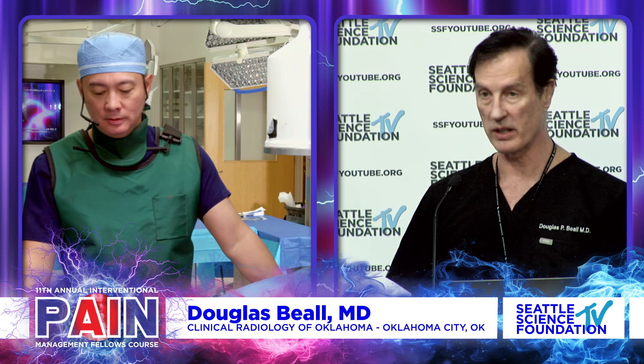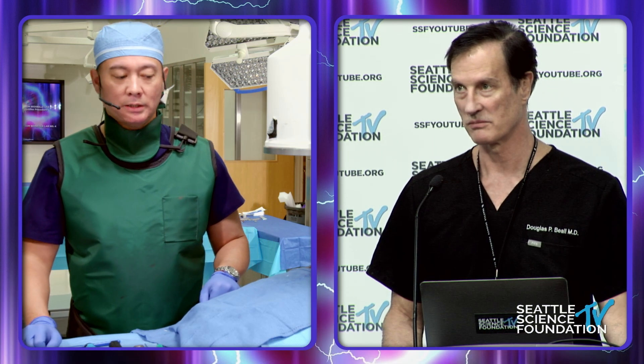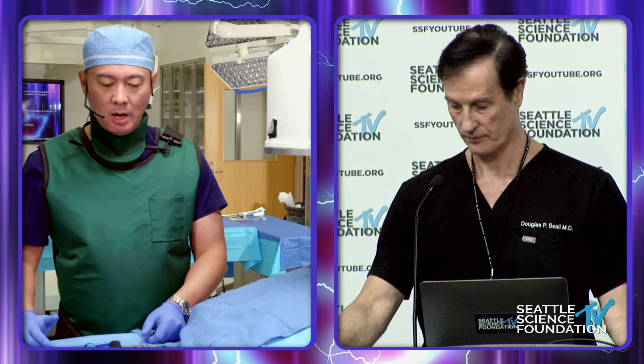We will move on to the SI joint fusion, the posterior approach with the cortical allograft, and this is going to be done by Dr. David. It looks like he's dressed and ready — locked and loaded. Dr. David: yeah, we are set to go here. Can you hear me well, Doug? Sure can. Awesome.